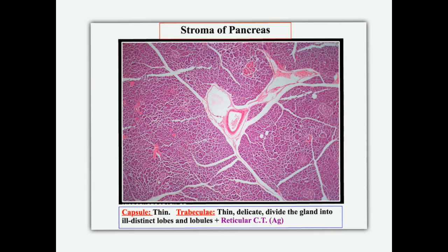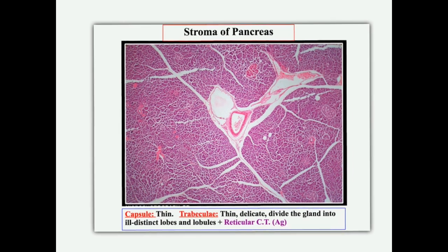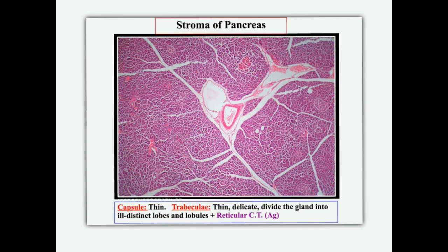The stroma is formed of a capsule which is very thin, and the trabeculae which arise from the undersurface of the capsule are also very thin. Accordingly, the gland is divided into indistinct or ill-defined lobes and lobules. The lobule is not completely separated, as you can see, nor are the lobes. In addition, there is a background of reticular networks stained by silver.